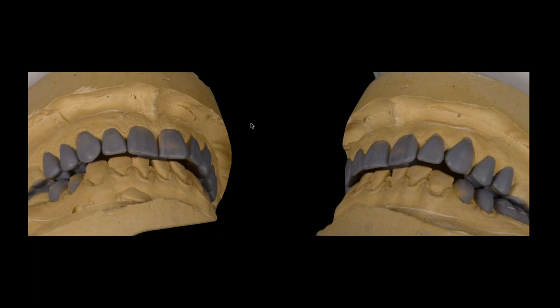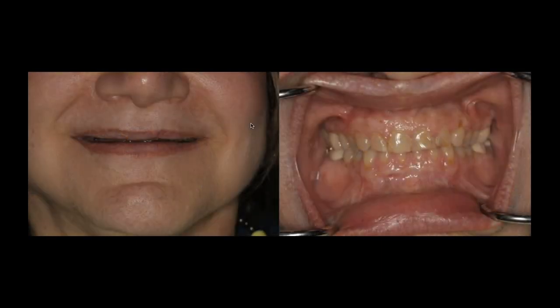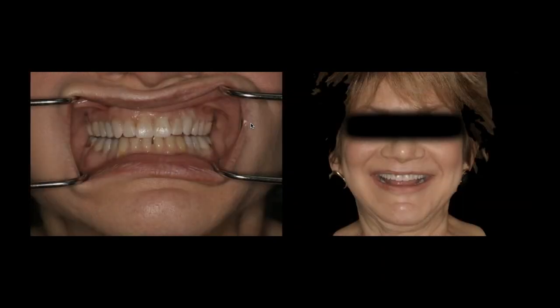And we can actually scan this wax up now with my little deprogrammer on it. And I can actually mill out a shell provisionally that the doctor can prep and place right in the mouth. And we have a whole sequence of how we apply that. So in the end, we're going to take what we see in the face and the white and the pink. We're going to incorporate that by doing an aesthetic evaluation, which is very standard for us.